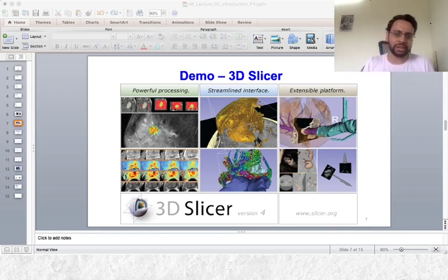On the other hand, if you want to do visualization aspects of it, this is by the same company Kitware that has developed primarily the ITK. You have VTK also. This is the visualization toolkit. For example, 3D Slicer and ITK-SNAP that you have seen use both ITK and VTK on the back end.